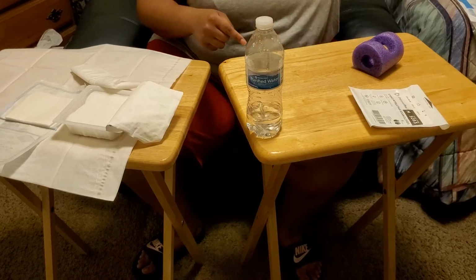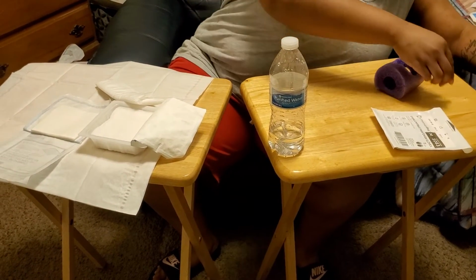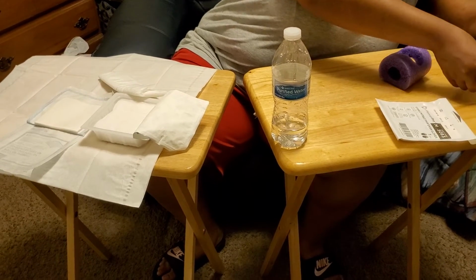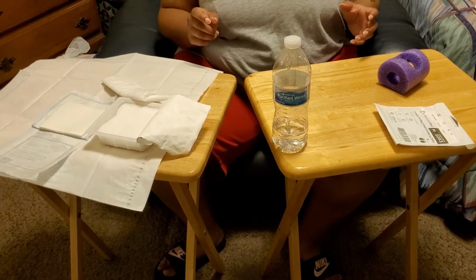Okay. So now that everything is together, have my tape, all of my open sterile materials, I can now put on sterile gloves.